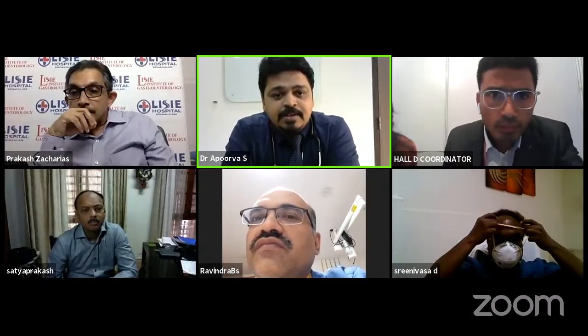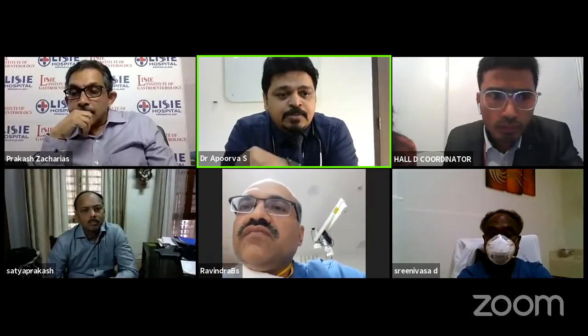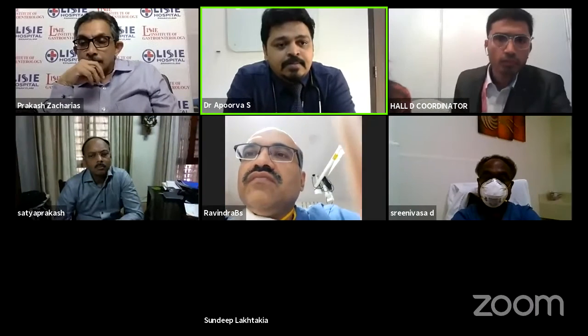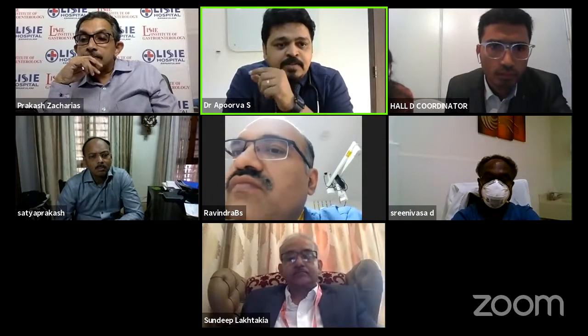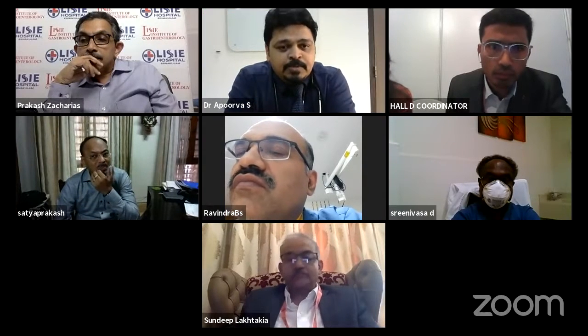Sir, one comment. Since many postgraduates and DM residents are there, the important thing when you do any EUS drainage is the close apposition; the distance should be less than 10 millimeter, that is less than 1 centimeter. The other thing you have to see is the thickness of the cyst capsule, whether it is matured or not. Then the third component is the content of the cyst. So before doing any procedure, especially cystogastrostomy, there should be good apposition to the wall of the stomach. So the distance should be less than 10.